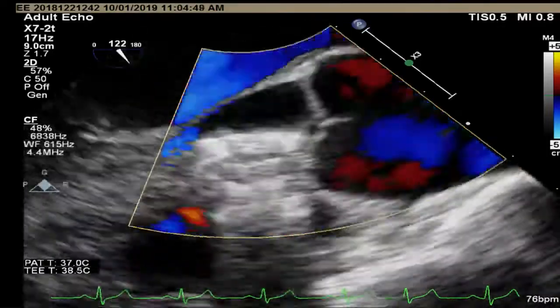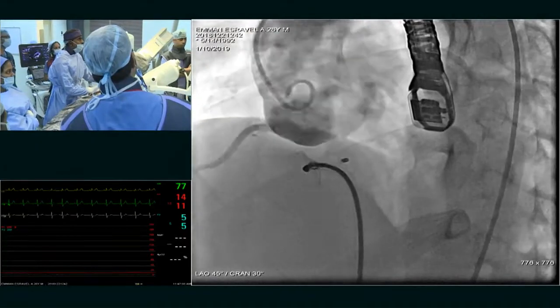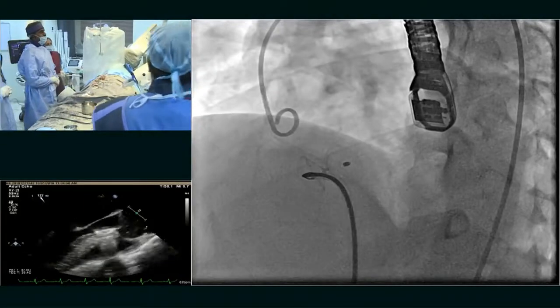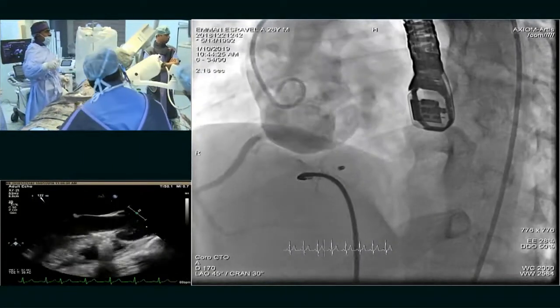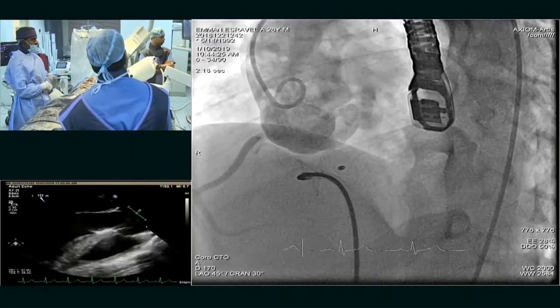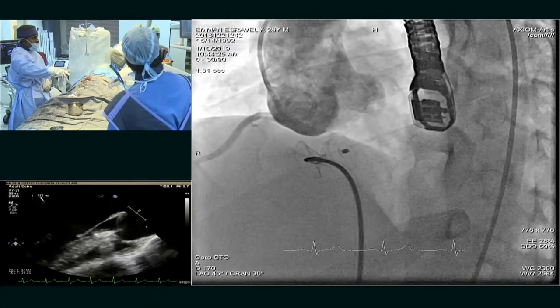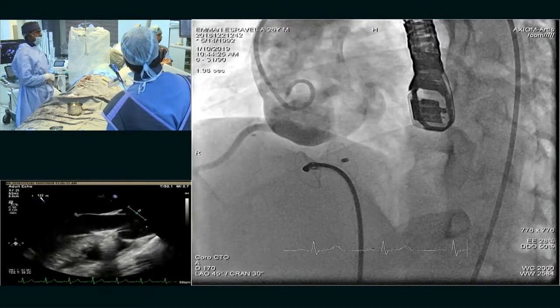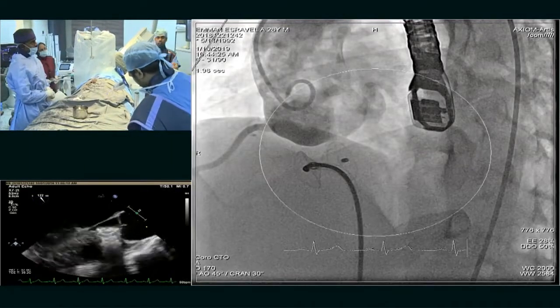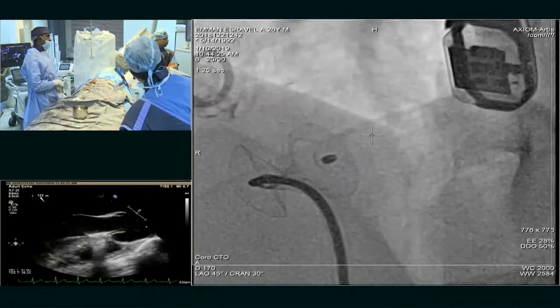So go live on angio. So that is the angiogram. Freeze it. Okay. Just go back. Make the valve open out. Yeah. Keep on going. Yeah. No. Go next frame. I think there is a small gap there. Mag one more mag on this. Yeah, just move the frame. Go back.